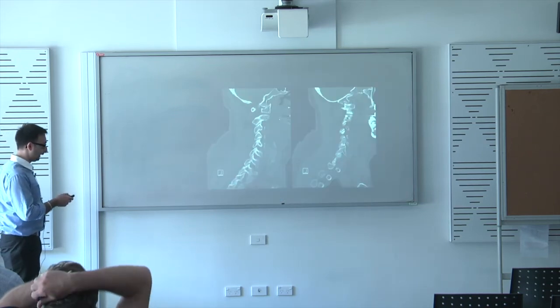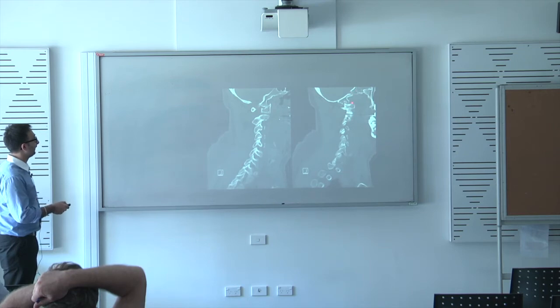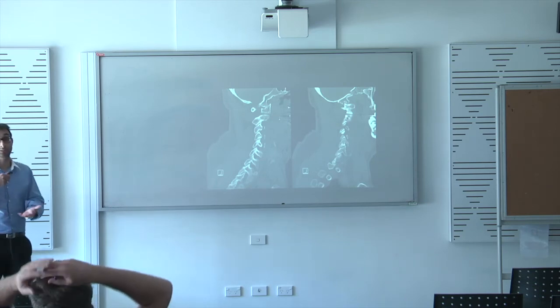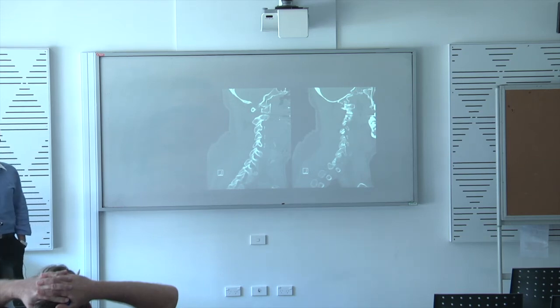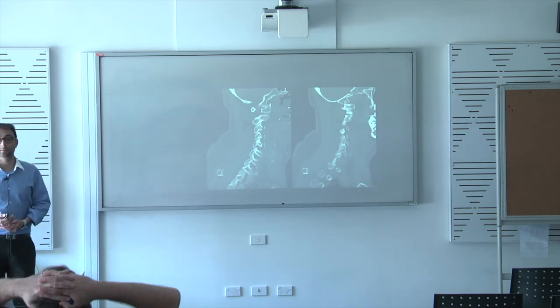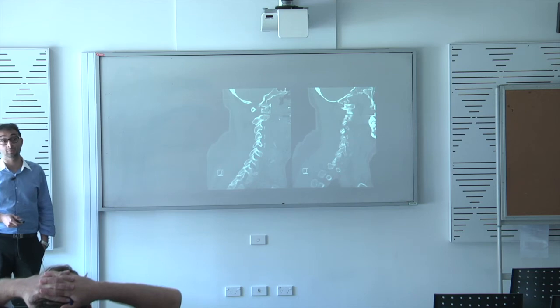So we end up getting a CT, and what it basically shows, this is the occipital condyles here. This is C1, so this is where the occipital condyles would sit. Basically, they've subluxed one side. I'm not sure if this is the left side, I think. And then the right side of the alignment's not quite normal. So this is like a craniocervical dissociation injury, normally seen in the setting of pretty severe trauma, and they can be pretty subtle to see on the plain film. I know plain films are sort of obsolete nowadays if someone comes in with major trauma, but it's still worthwhile being able to see what the abnormality is, and often we just go to CT anyway if there's any clinical concern.